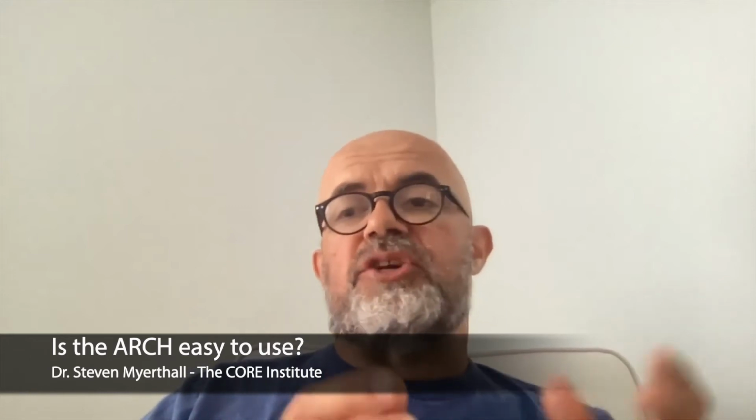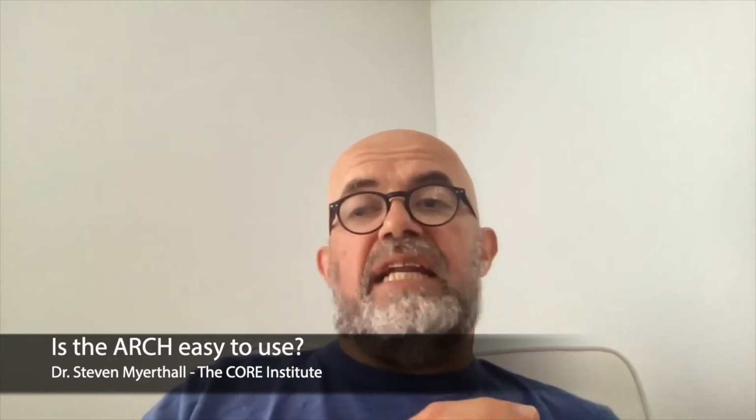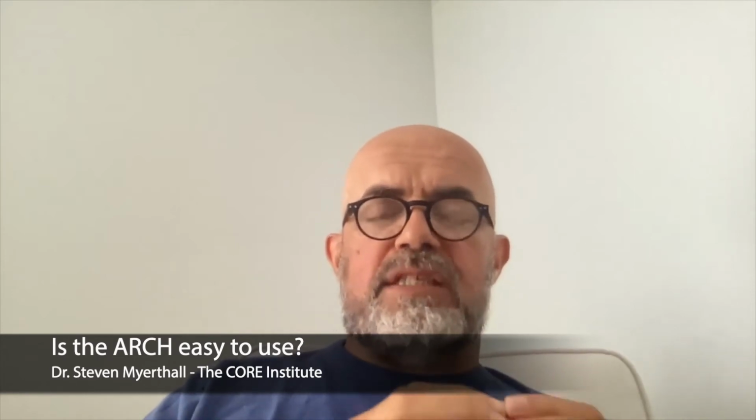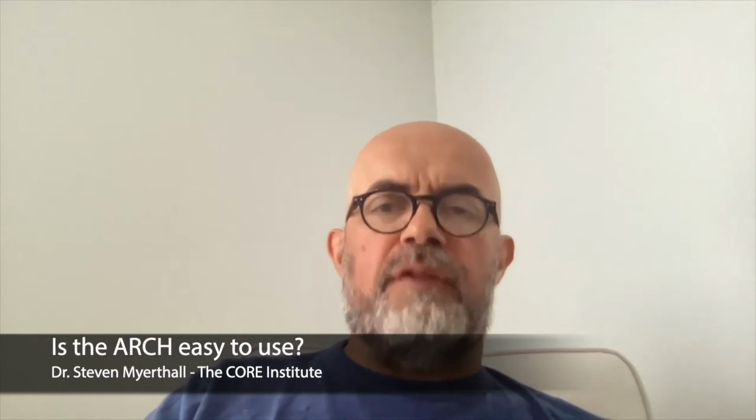I think that it is much easier to direct your table operator how to put the leg into different positions during the procedure, because it's all indicated there and it's all marked there in terms of the numbers, and you can lock it into a position and so on. For instance, after I've done my releases around the femur and I want to expose the femur, I will just tell my table operator to lower the foot 2 clicks on the arch.